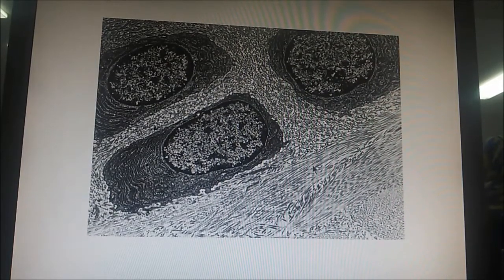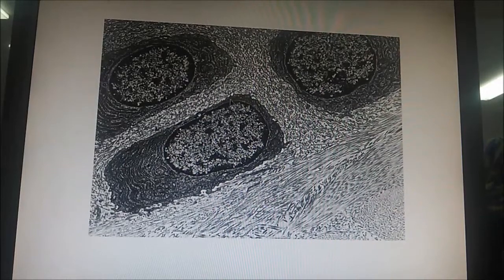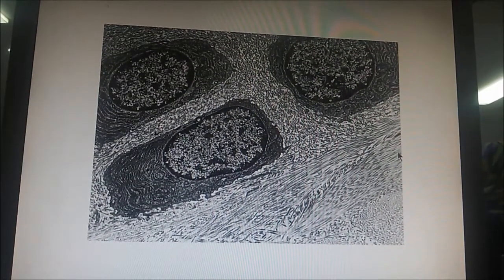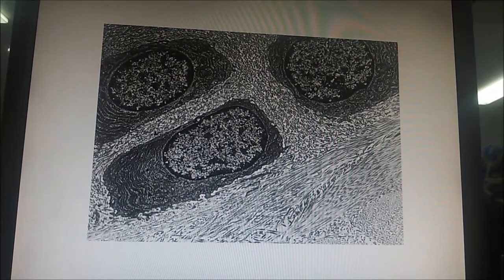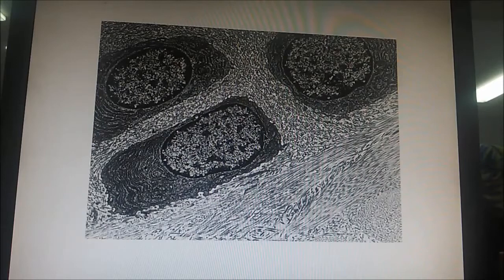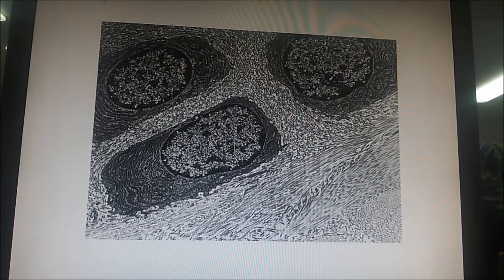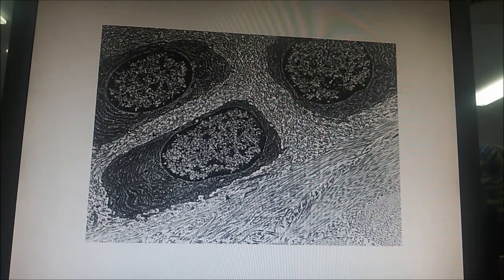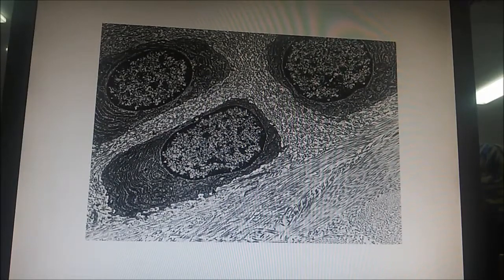Around the chondrocyte you can see this collagen. It is surrounded by the matrix. This picture is taken from fibrocartilage, and this collagen is collagen type 1. But you are not required to know what type of cartilage it is here. What you are required to know is that this is a chondrocyte, with an oval nucleus peripherally, a large amount of RER, and the cell as a whole is approximately rectangular, and its cell membrane is a bit folded.